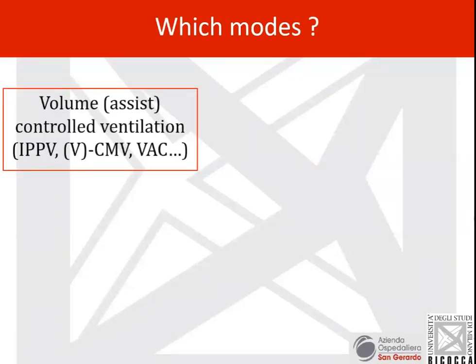Of course, the most, I would say, classical one, also from a historical perspective, is the volume-controlled ventilation. Unfortunately, this is something that sometimes we struggle with, especially with our younger colleagues, that the same ventilatory mode has different names on different brands of ventilators.